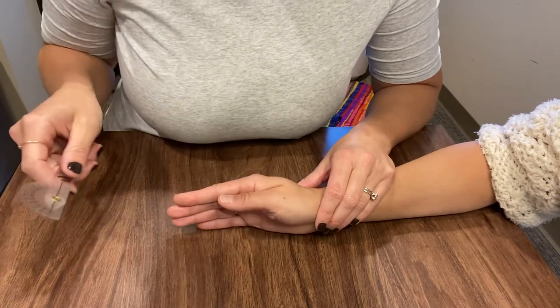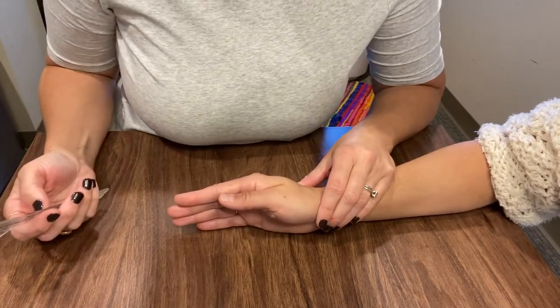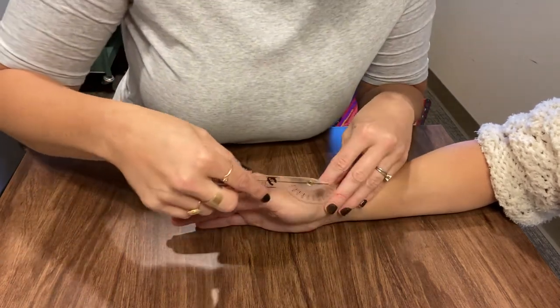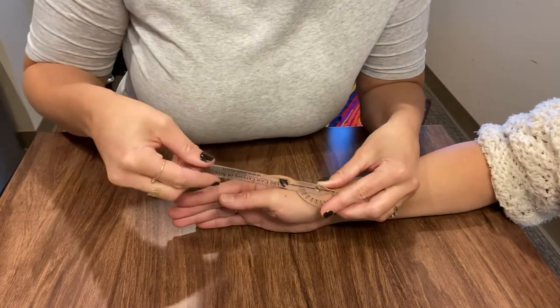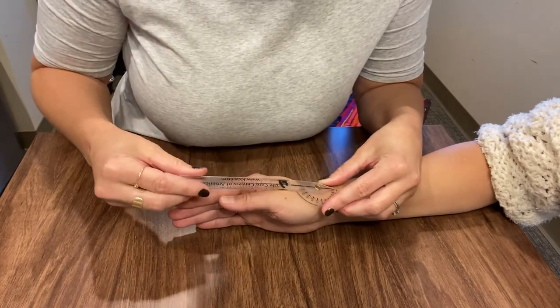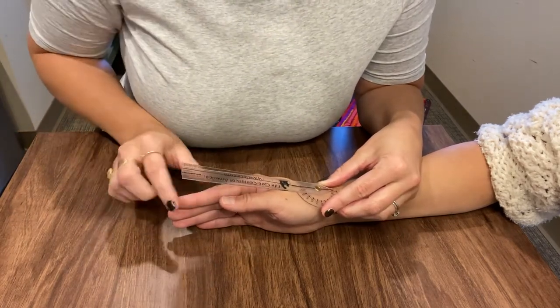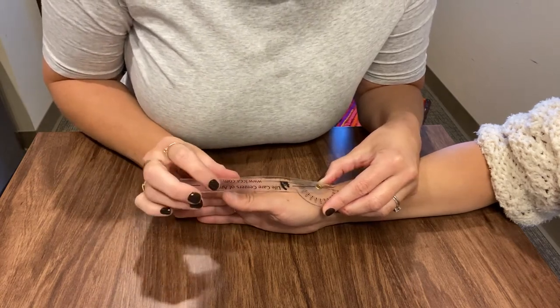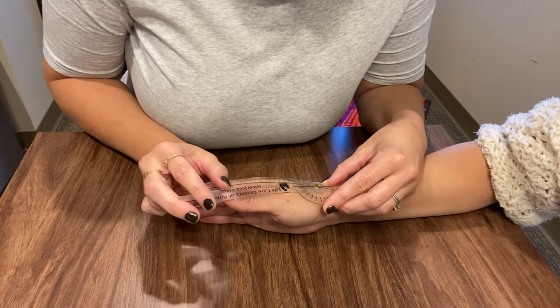The muscles are the abductor pollicis longus and the abductor pollicis brevis. Again, this is going to be a little bit of subtraction. You are going to stay with the midline of the second digit and take her from her neutral.